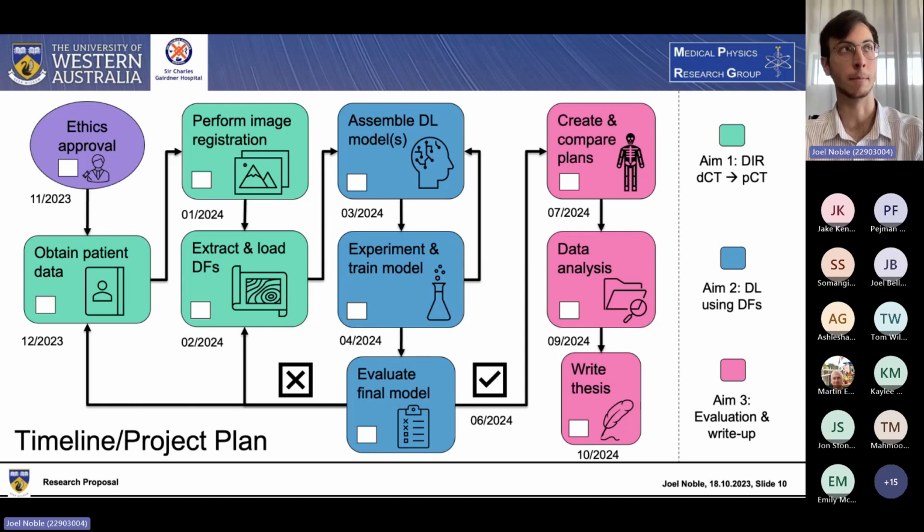Yeah, absolutely. I would tailor it to the model architectures in question. So as I said, if it was a GAN, then you'd have the adversarial loss. But again, the Deep Perfect authors provided some good guidelines in the way that they were weighting the different aspects of the loss function with simple hyperparameters. So you could combine both the different terms of the loss function and weightings for those terms. But again, I think that would be an area of a lot of experimentation.